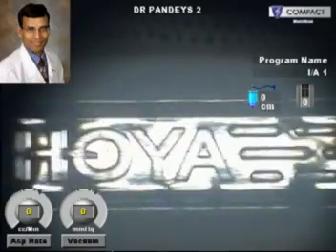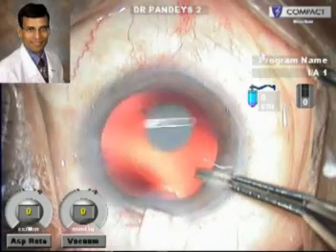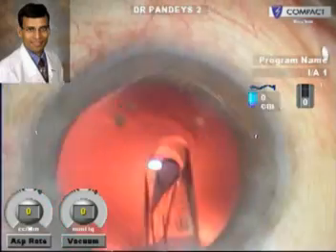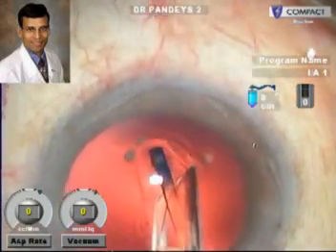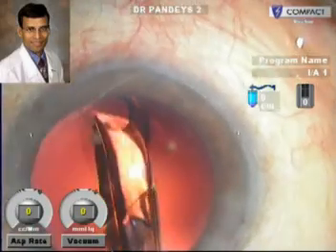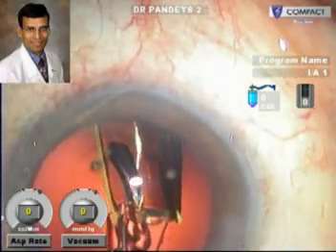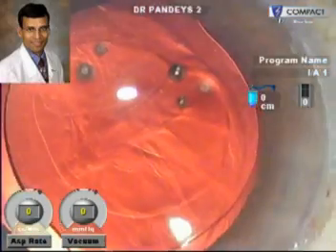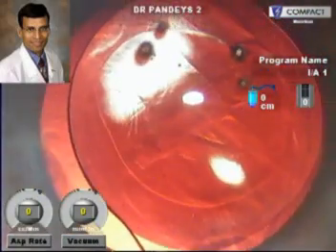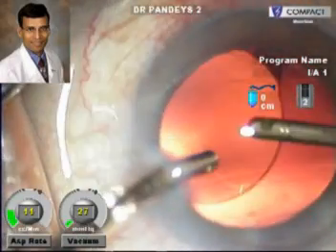Once the viscoelastic has been put through the infusion port, we remove the injector from its protective covering and advance the IOL within the injector, taking care to see that the haptic is properly tucked. This preloaded folded IOL is then implanted into the capsular bag. The delivery of the IOL is very smooth, slow, and predictable. As seen here, the IOL has been very well folded and goes straight into the capsular bag without any problems, and is very well placed and centered within the capsular bag.